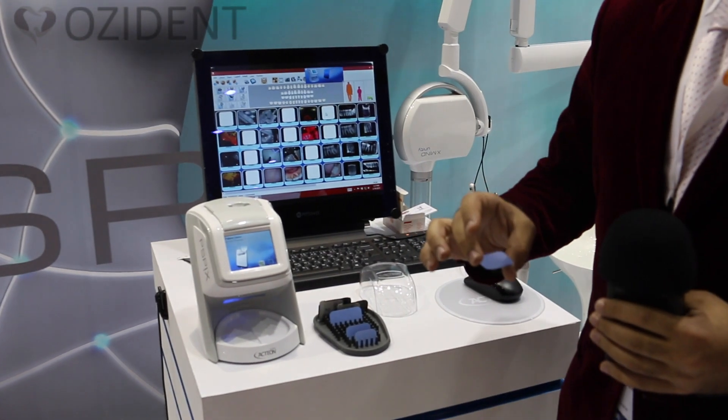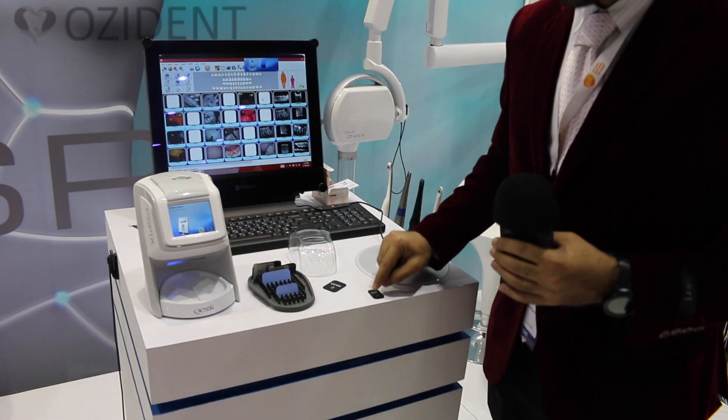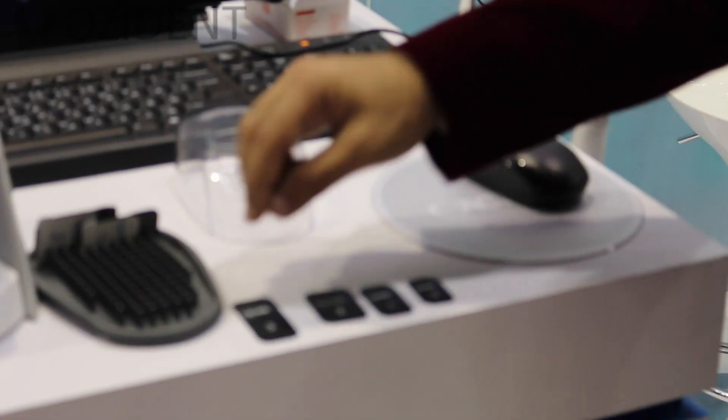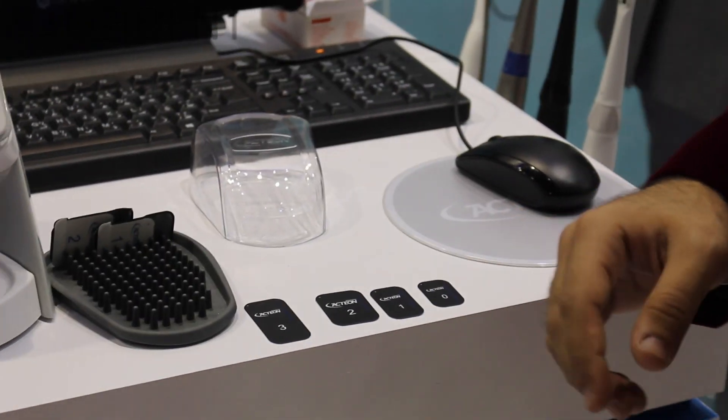It comes in 4 different sizes: size 0 for pedo, size 1 for endo, size 2 which is the standard size, and size 3 which you can use for bitewings as well as for occlusal imaging.